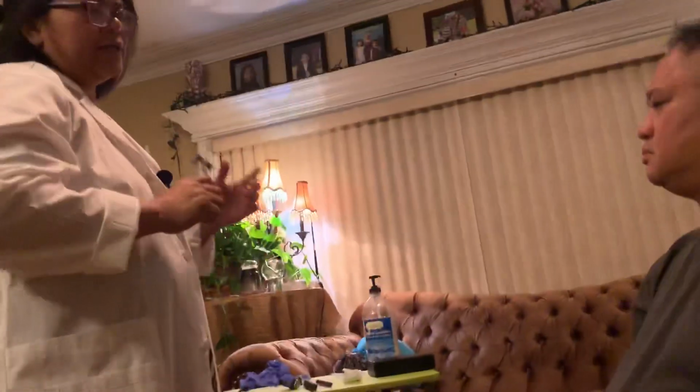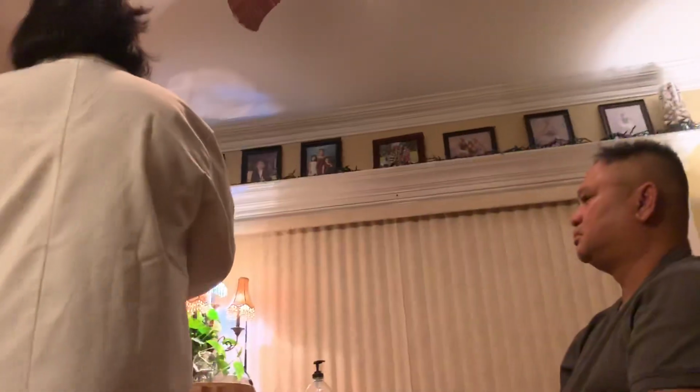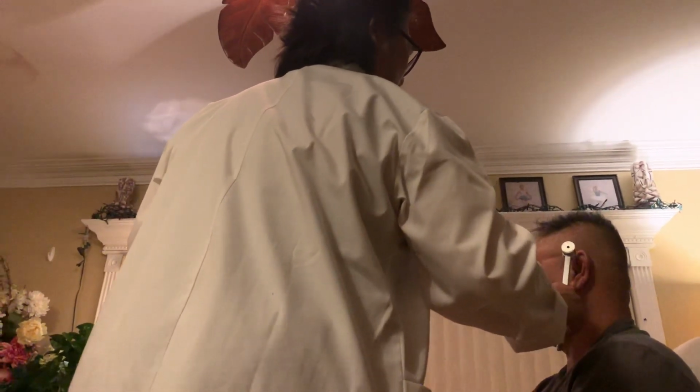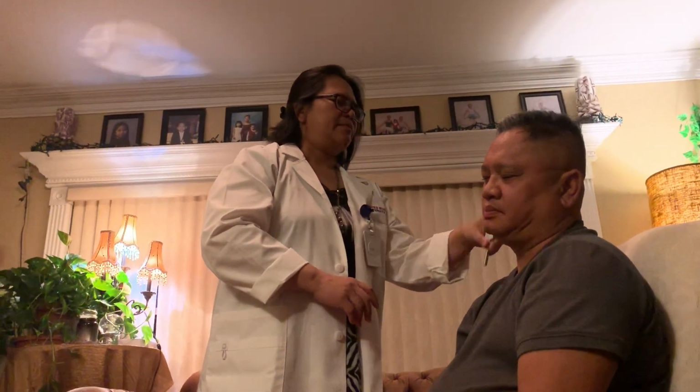With this test, I'm going to test both of your ears. I'm going to initiate vibration of the tuning fork, then I'll put it behind your ear. You tell me when you don't hear it anymore, and then I'll put it directly beside your ear. No more. Yes. Okay, no more. So let's test the other one. The same thing. You tell me when it stops. Stop. Stop. Okay, so that is testing the air conduction and the bone conduction of your ears, and both is equal.